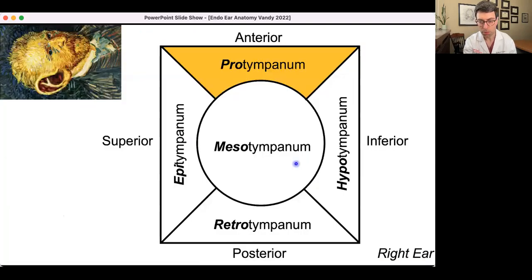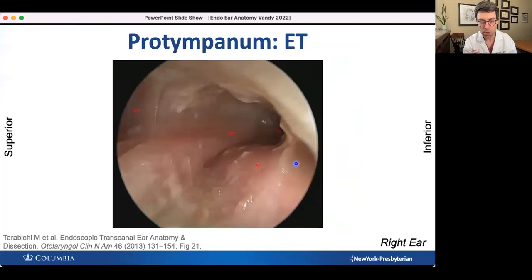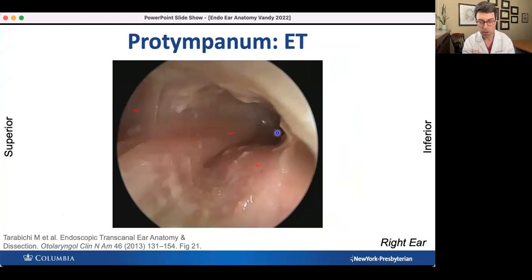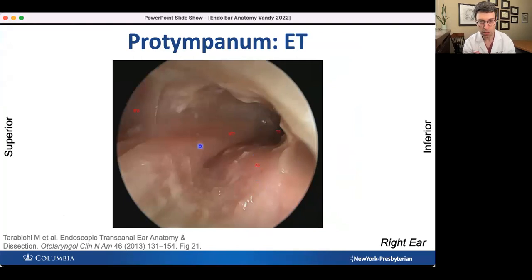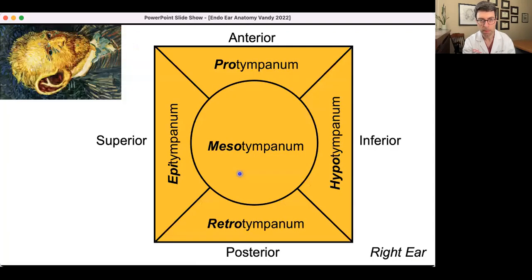Now let's talk about the protympanum, which is anteriorly located. There's not as much in the protympanum. The key thing is the eustachian tube — this black hole right here. Just inferior to the eustachian tube is the carotid artery, which you do not want to get into. The tensor tympani is located right here, and they both kind of go into the eustachian tube orifice.